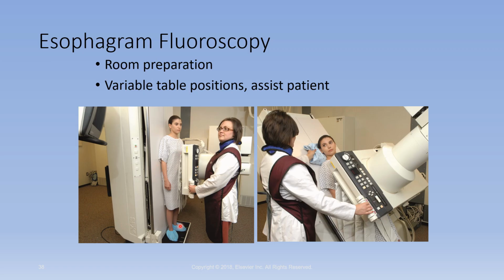Usually once they get some images of the patient upright, we give them the barium in their left hand. So the patient stands on the table in an erect LPO. The barium's given to them in their left hand so that it doesn't obscure anything when they drink. They would drink and the fluoroscopist would have them turn in different positions, and then they can take pictures with this fluoro tower.